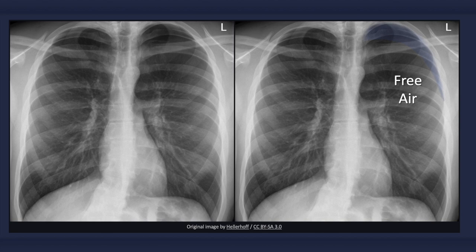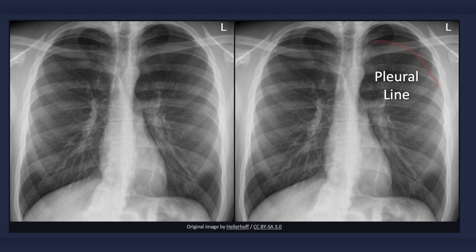Can you see a crescent of increased transradiancy in this X-ray? This area of increased blackness represents free air. Notice the lack of bronchovascular markings within this region. A very helpful sign of a pneumothorax is the demarcation of the visceral pleura on the X-ray, which is identified by a thin, sharp white line. This fine hairline opacity occurs between the lateral border of the lung and the free air in the pleural space. Notice the lack of pulmonary vascular markings in the area beyond the pleural line.